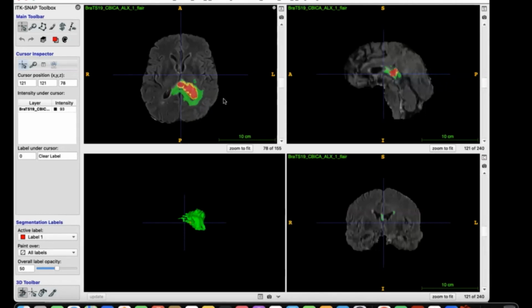I think in the second assignment we'll do this brain tumor segmentation. You will know better what types of tumors are encoded with different colors. And this also is a 3D view of these tumors, right? They overlap with each other, with this yellow, green, and red here, right?